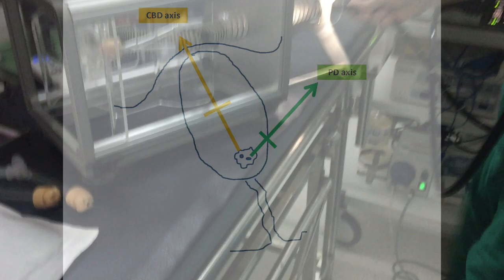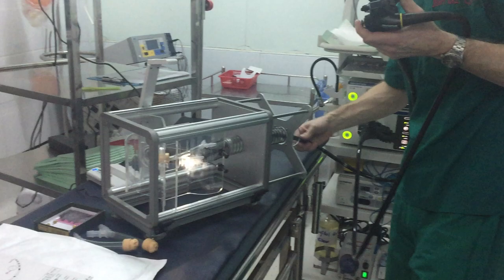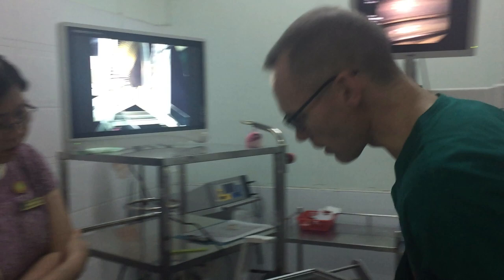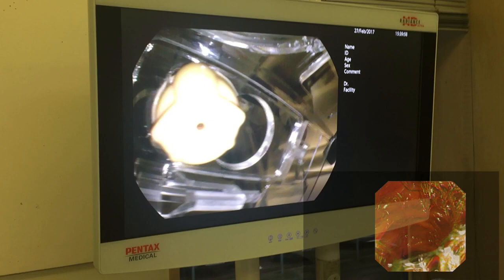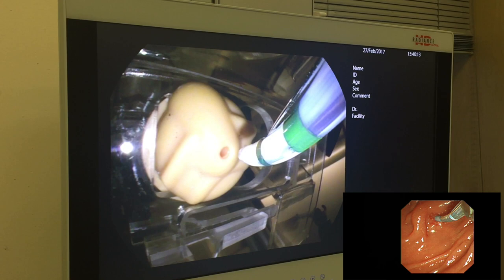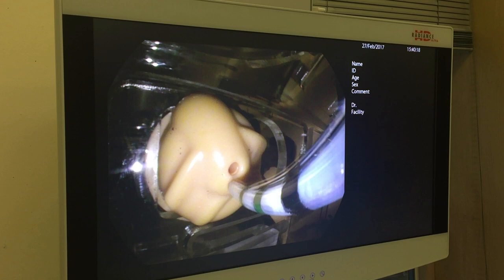To start with we're going to need access to the common bile duct. Now we've got the Cook Endo trainer where we're in position in the second part of the duodenum. We've got alignment with the papilla and you can see the intra-duodenal portion of the bile duct coming up from the papilla. First thing I'm going to do is advance the sphincterotome out to the end of the scope and try to get the angle of the tone to match the angle of the intra-duodenal portion of the papilla, and then by manipulating the tip of the scope closer and the elevator we can just try and engage the tip right in so that we can then strip the wire.